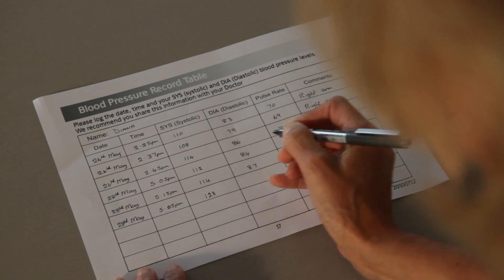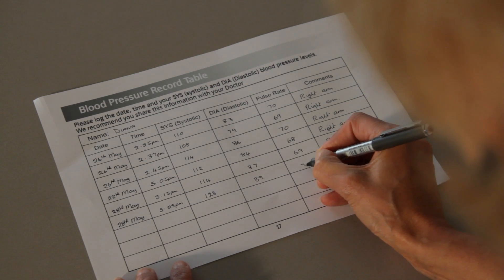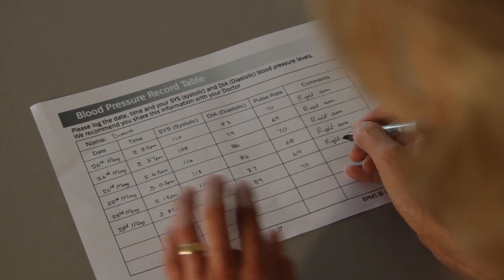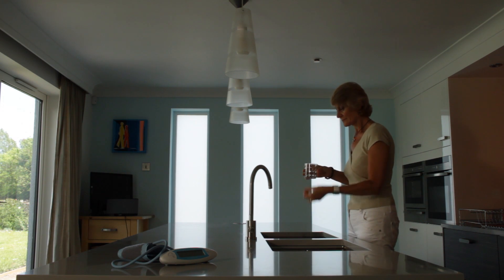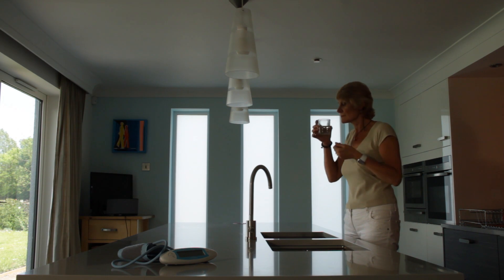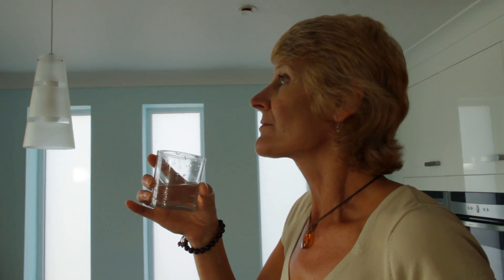Keeping a record of blood pressure measurements, along with the date and time, is very important, particularly in relation to when blood pressure tablets are taken. It is very important that you do not alter how you take any medication as a result of blood pressure readings done at home, unless you are advised to do so by a doctor or nurse.